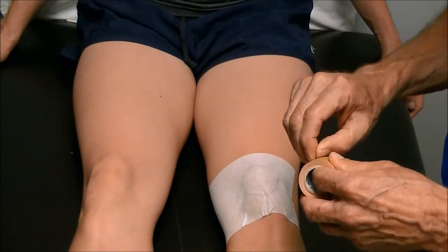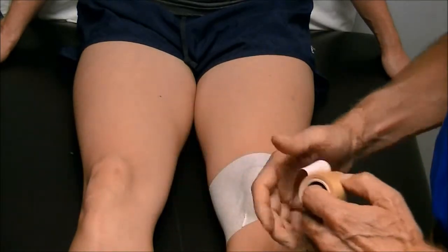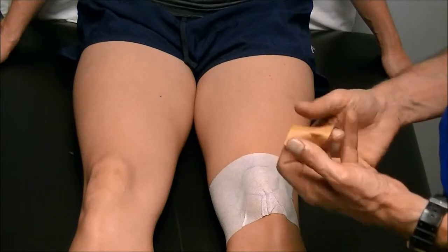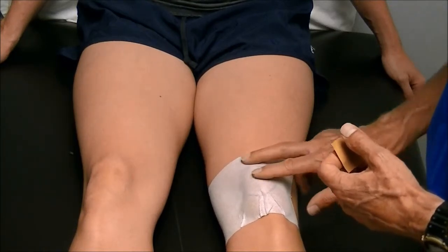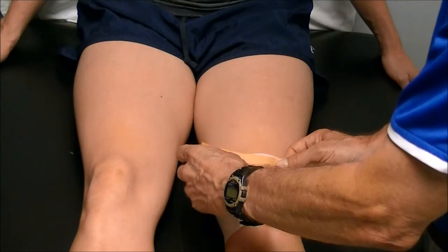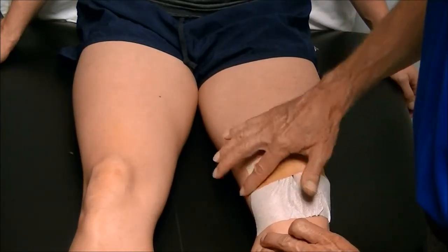For the Leuko tape, if you use the cover roll as a template, you want to go about an inch and a half to two inches smaller, because you don't want to get this tape on the skin — it will take skin off. The first strip: you go halfway on the kneecap, halfway off the kneecap, proximal or above the kneecap. We go a little bit to the outside, and always test the skin to see how much it moves — some people have really tight skin, some don't. So we go about an inch outside the kneecap, pull it to the inside. Roll it out so it stays on the cover roll and not on the skin.